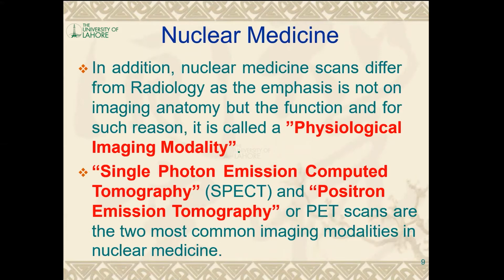You can also say that nuclear medicine just scans. Basically, it emphasizes not anatomy, but the function of the internal structure. That's why it's called a physiological imaging modality. As you know, anatomy means structure, physiology means function. So nuclear medicine mostly emphasizes the function as compared to the anatomy of the body.